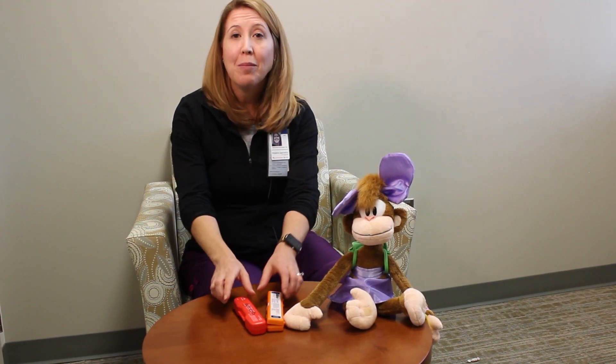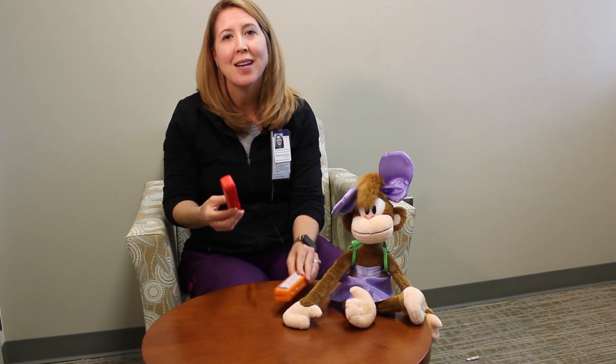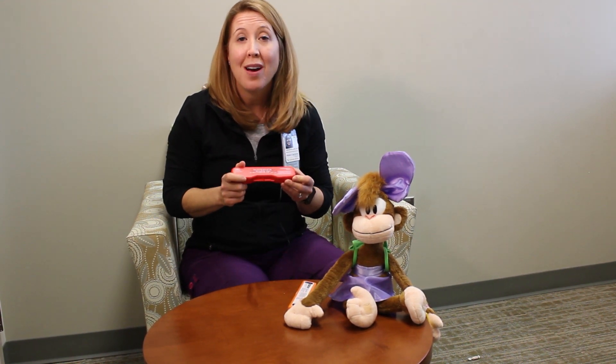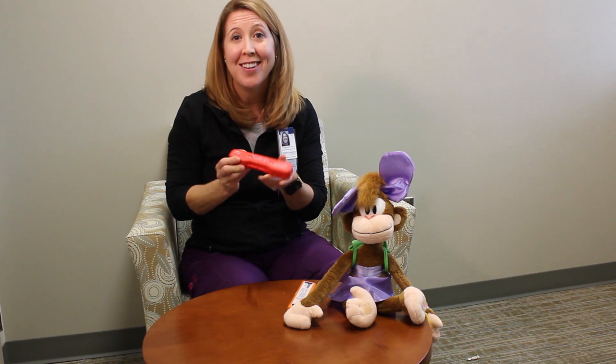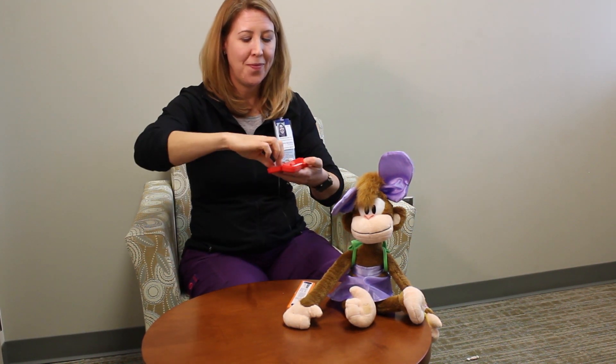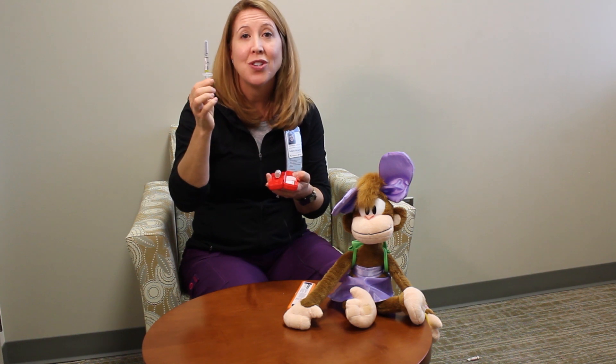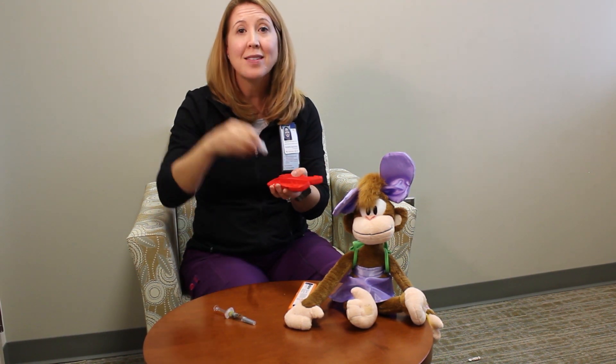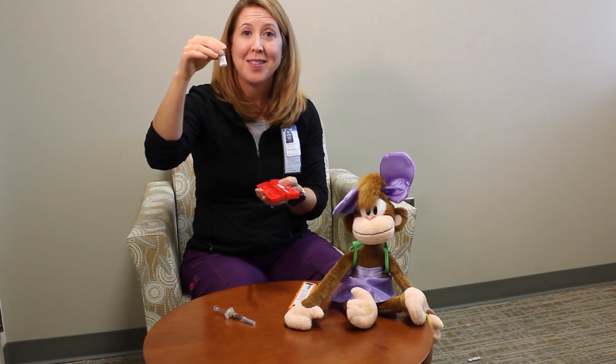So let's go ahead and review how to give glucagon. Your kit may be orange or red, but the inside contents will be the same. Everything you need to give a glucagon injection is all here. Let's open it up and see what's inside. You're going to have one syringe that's filled with clear liquid. The next is going to be a bottle with a powdered substance in it.